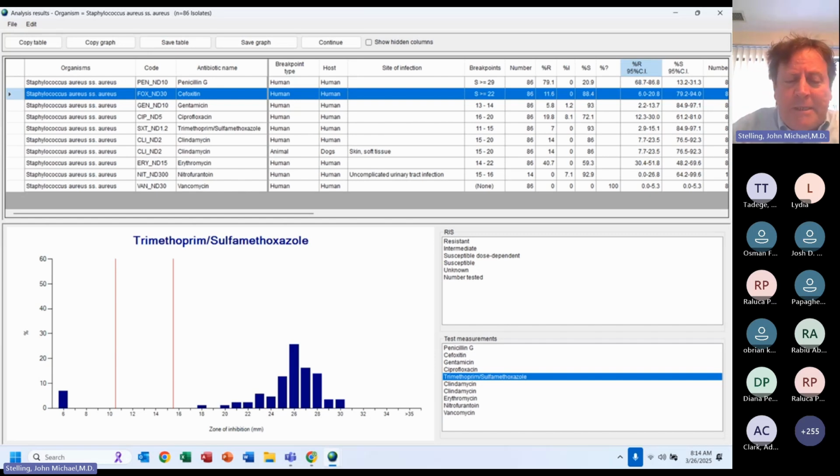My suspicion is that between 16 and 21 it might be resistant to sulfa, but susceptible to trimethoprim. From a clinical perspective, either drug should work, but it's good to know that cotrimoxazole has synergistic killing for these, whereas here it's just relying on one of the two drugs. So that's just an example of how the measurements can help you understand the populations at a deeper level.